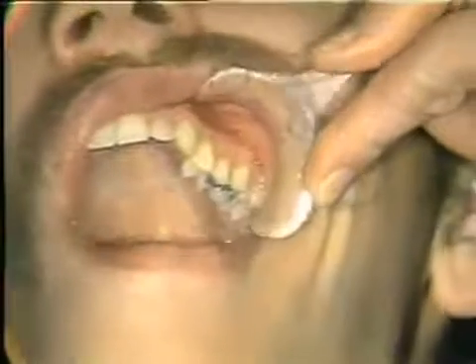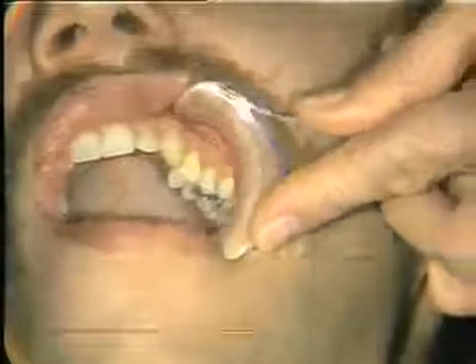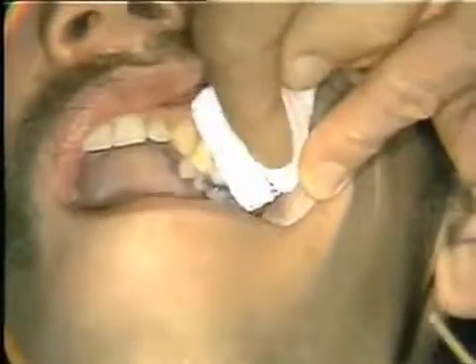All right, let's see if we can show it nicely here on the patient. Again, we're using our retractor, which normally isn't necessary, just so you can see a little bit better. First we'll dry our mucosa, and you might close just a tiny bit. At the same time, I'm palpating the malar strut. I know where it is, about here at the second molar. Then we'll use a little betadine again, as usual, in our injection site, well out in the vestibule this time.